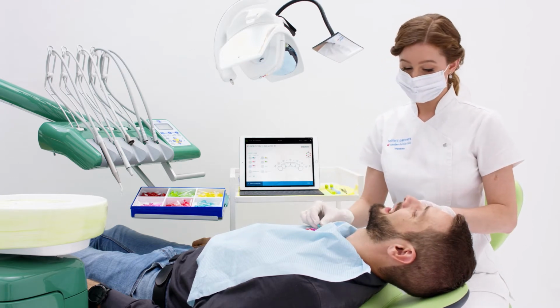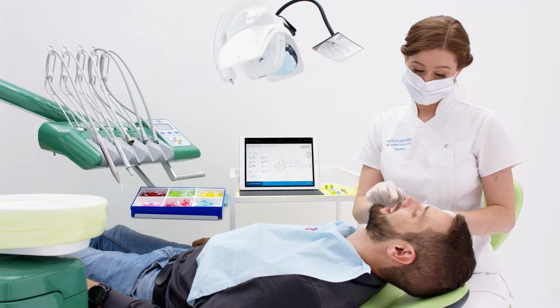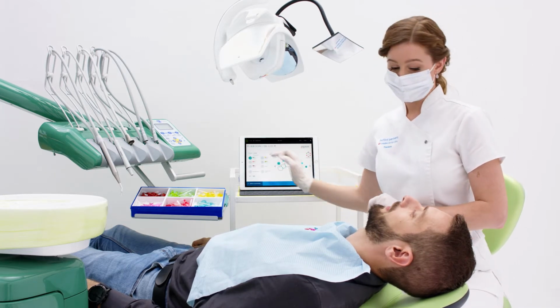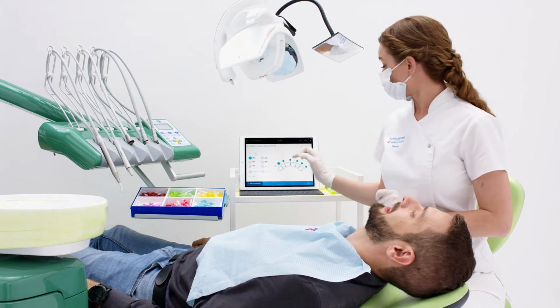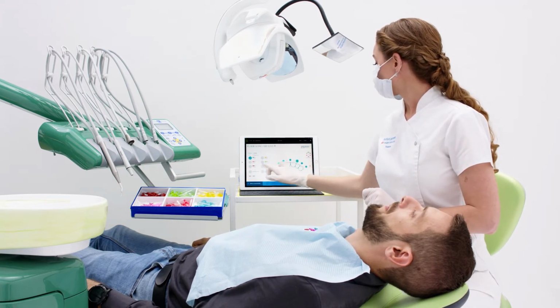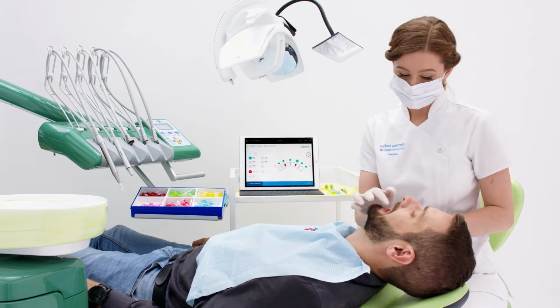The upper anterior sextant requires only 1 size of interdental brush, so I simply hold down onto that colour button, which then infills the whole sextant with that 1 colour. I also then input the areas with inflammation.